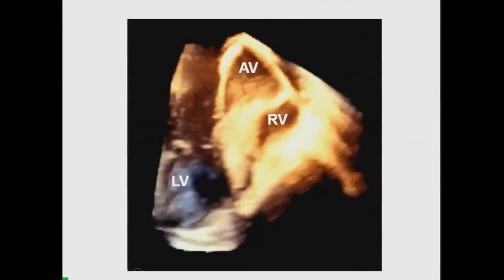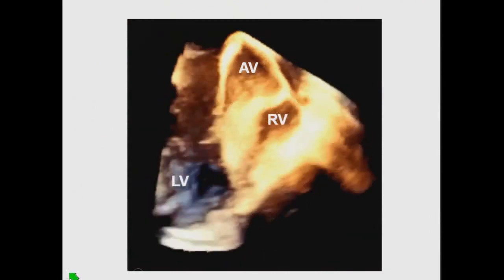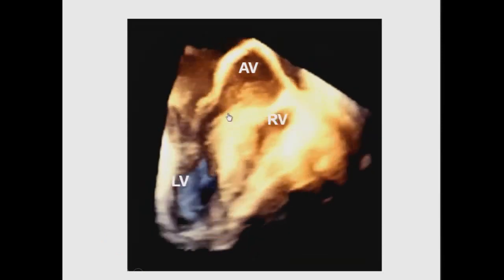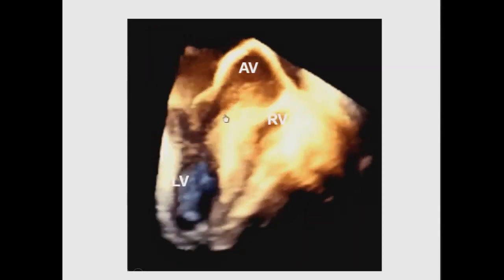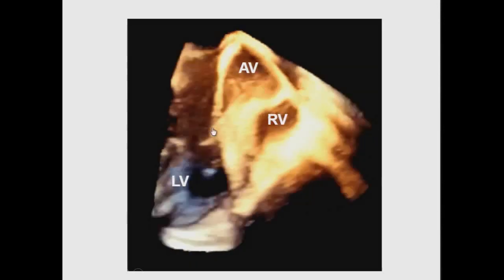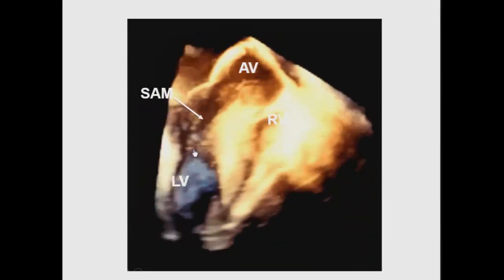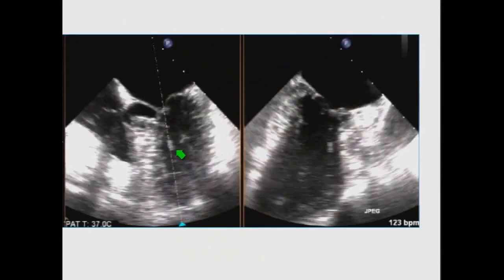So this is a representative three-dimensional image drawn at random from our files. That is to say, one of the nicest 3Ds we've done in the last few years. And it shows, I think, in beautiful detail. We actually Kronzenized this 3D just for this. Dr. Kronzen was at our institution and gave us some very important tips on how to optimize a 3D rendering. You see, actually, in beautiful detail, the systolic anterior motion of the mitral valve and septal mitral contact in a patient with hypertrophic obstructive cardiomyopathy. So that's what this is actually showing.